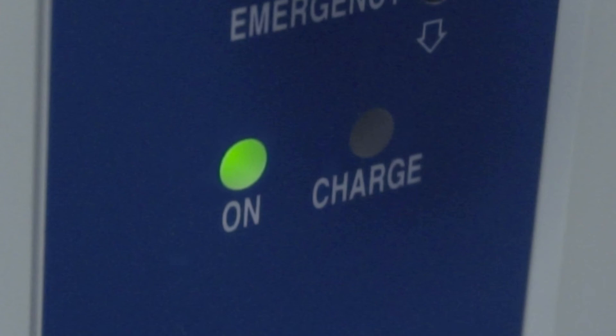The charging time for the battery pack is approximately four to five hours. However, you may leave the unit plugged in as long as you like. The charger will not overcharge the battery.